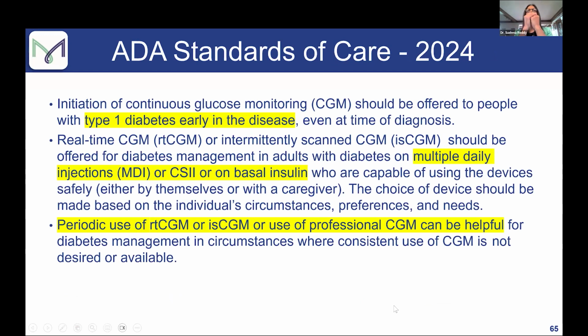And that's what we were alluding to earlier, in patients who don't have hypoglycemia or are not on insulin, a one-time wear to adjust medication or to give that patient empowerment and behavior change, and have them find out how they respond to different foods or physical activity, is very helpful. And that is now in the ADA standards of care, saying it could be helpful in circumstances where consistent use is maybe not desired or available, but a one-time or periodic use could be beneficial.